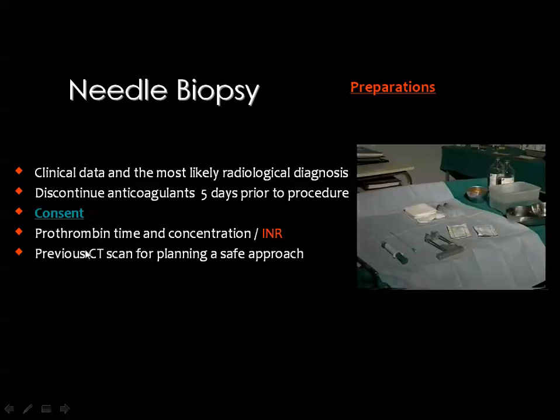Then you should have a look at the coagulation profile of the patient, especially the prothrombin time and concentration, as well as the INR. The previous CT scan or the previous imaging techniques should be available for planning a safe approach for your needle.